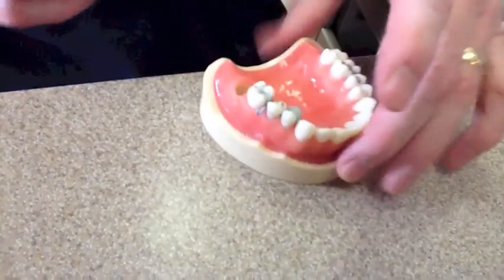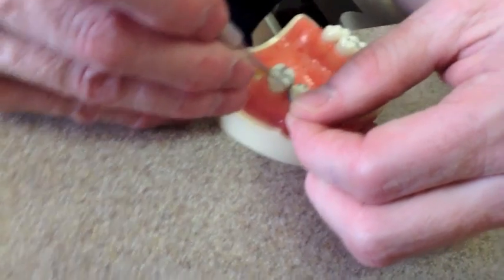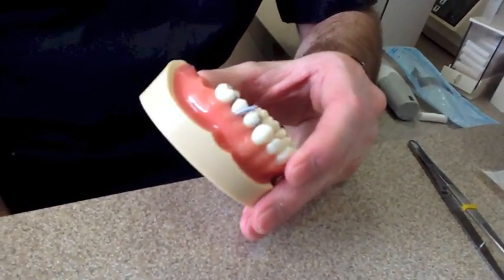Now I'm going to turn it just so you guys can see. Now we're back to the front. I'm going to push it. If you remember, I started in the middle. And bam. Okay, I'm done packing cord. Now with the blue one, you leave it out. The second cord you pack, you just leave it out.